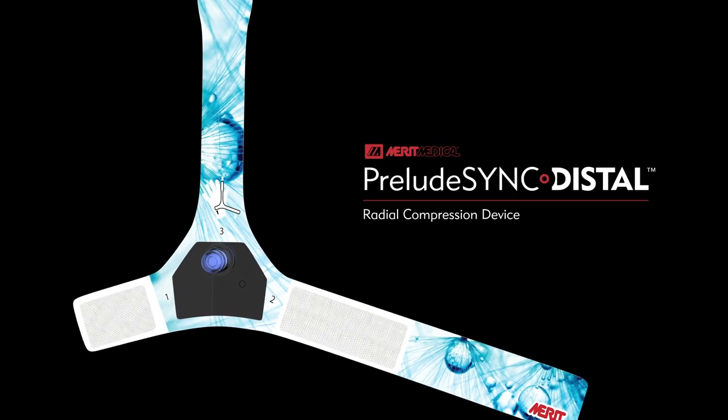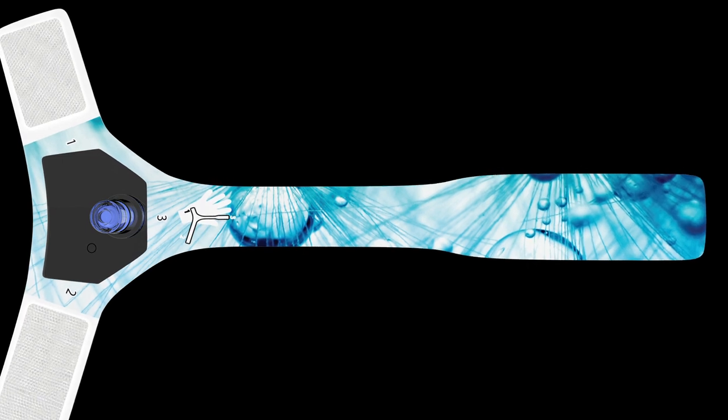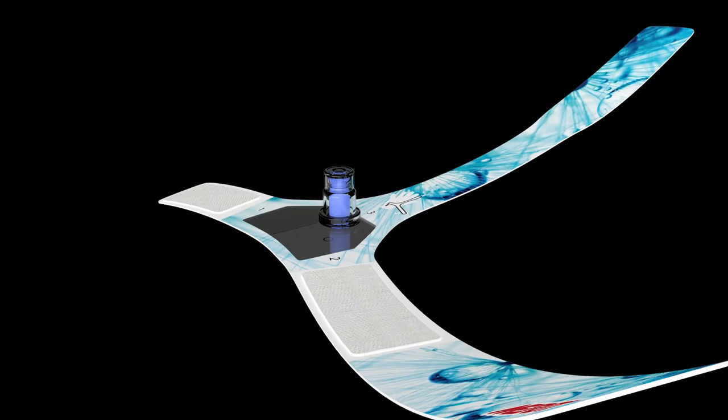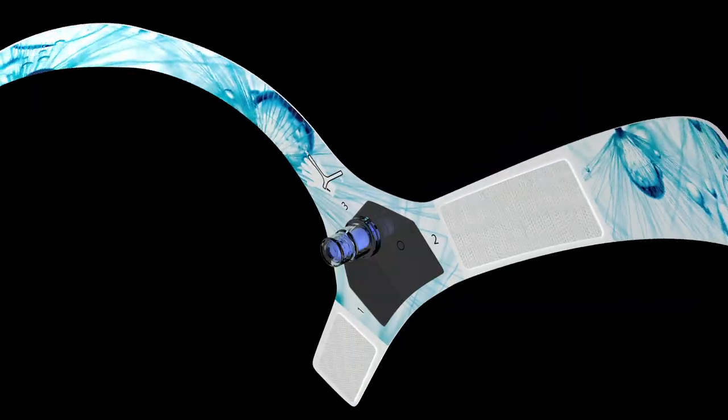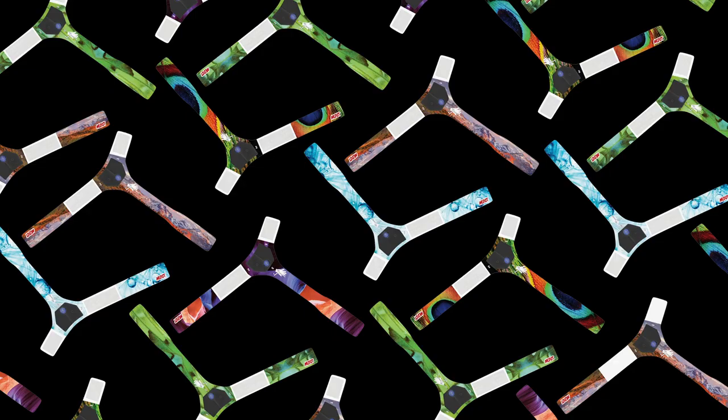The Prelude Sync Distal Radial Compression Device is a hemostasis device designed specifically for distal radial artery access sites. Prelude Sync Distal combines proven comfort and effectiveness with a unique band configuration and a variety of attractive designs.